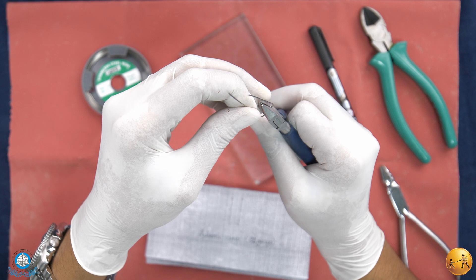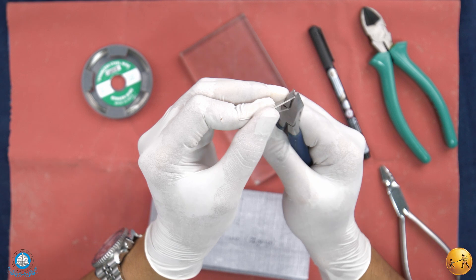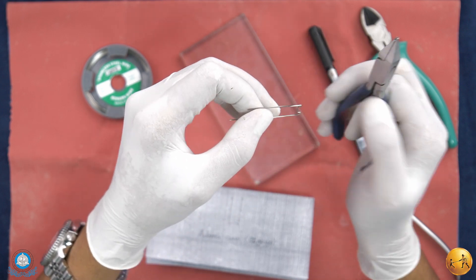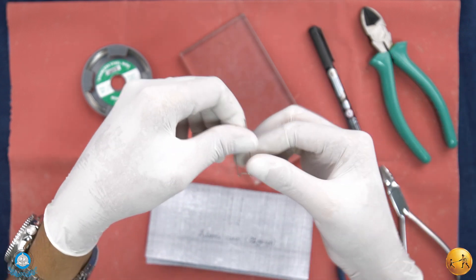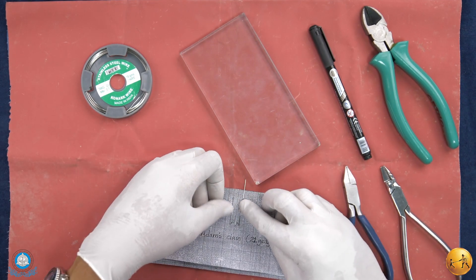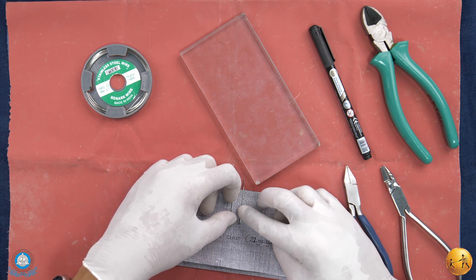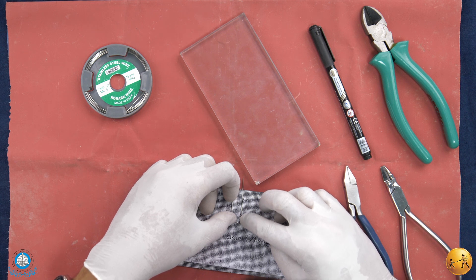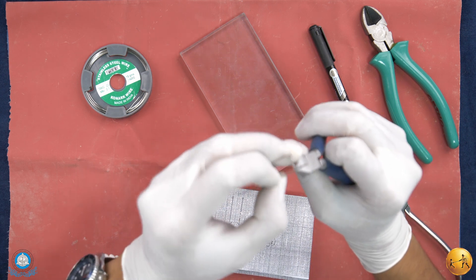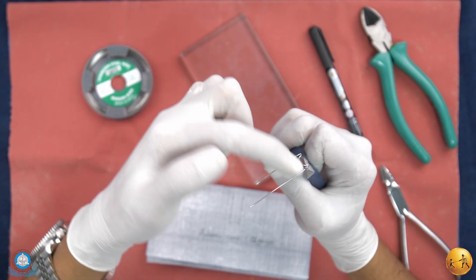Once this is done, decrease the width of the arrowhead. Both arrowheads are almost ready. Check the arrowheads on the outline provided and straighten both end sections.